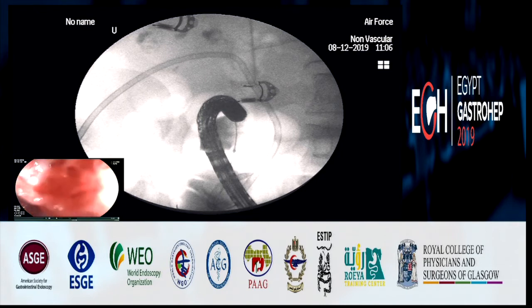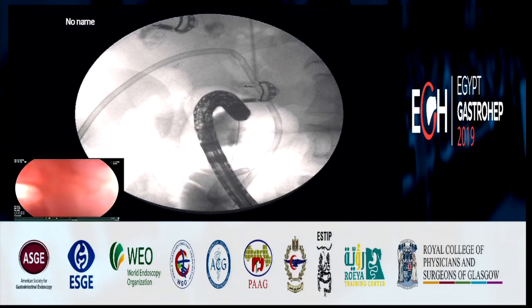I'm a little bit afraid for the EUS hepatico gastrostomy, because if you see, you have some air now in the bile duct. I will try. And this can induce some difficulty. It can be challenging. I'm sorry. No, that's life. That's life. Okay.